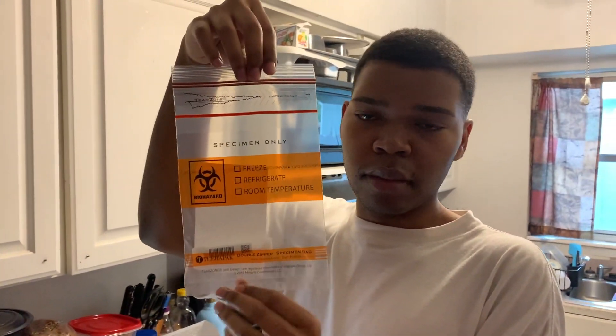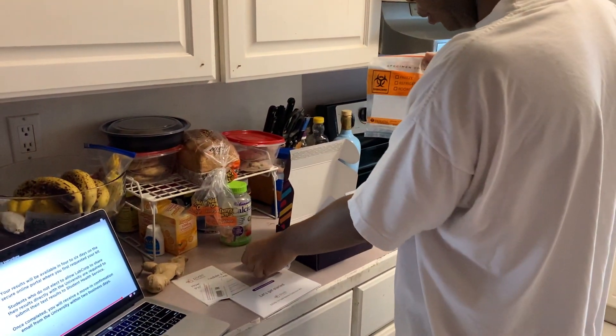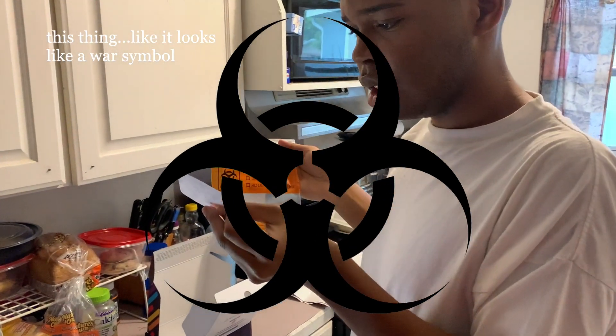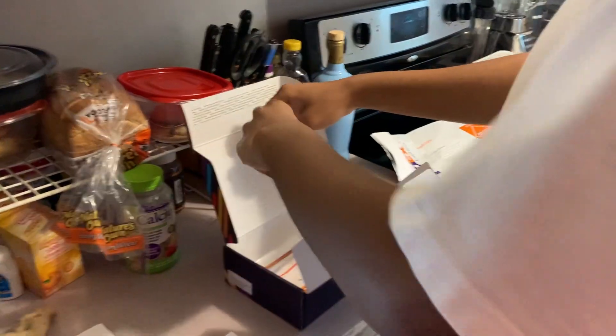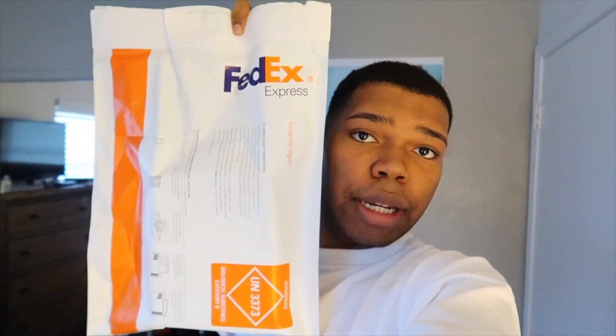Look at the bag — it looks dangerous. Whenever I see that biohazard symbol in the middle of the bag on the orange line, I get so scared. Then I put it back in the box, and now it's ready to be shipped. We have to drop it off in one of the drop boxes, and then they're going to send it to the lab to see if I have coronavirus or not, and I'll get my results in four to six days.